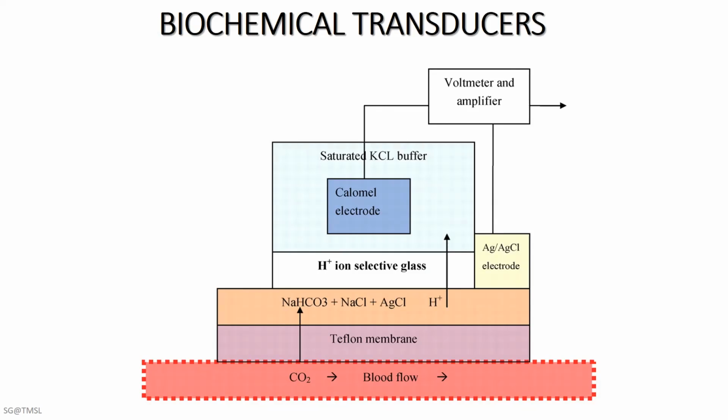The space between the Teflon and the glass contains a matrix consisting of thin cellophane, glass wool, or sheer nylon. This matrix serves as the support for an aqueous bicarbonate layer into which the CO2 gas molecules can diffuse.